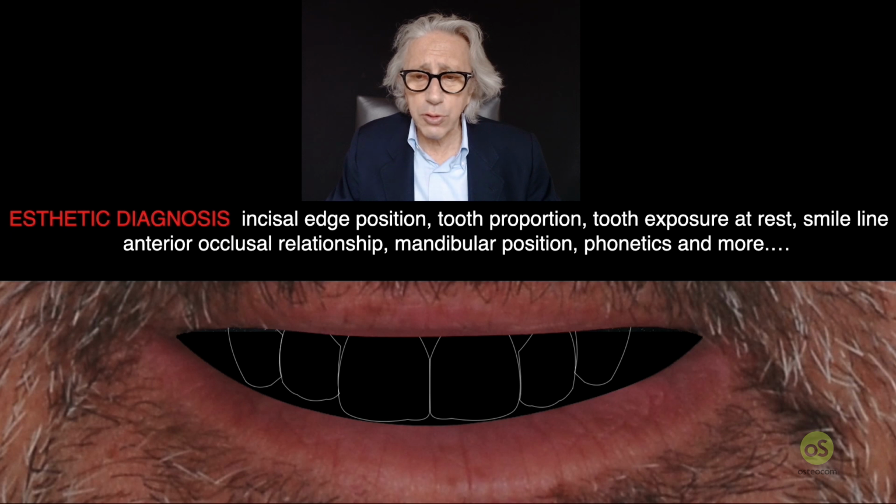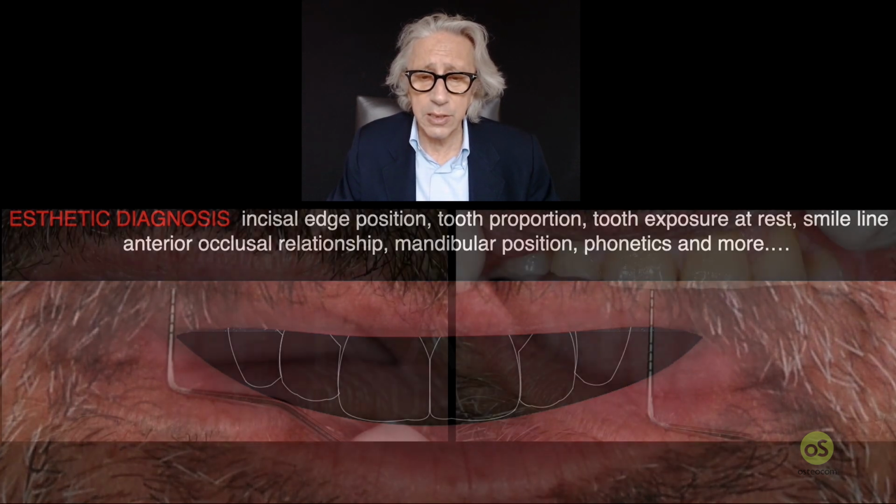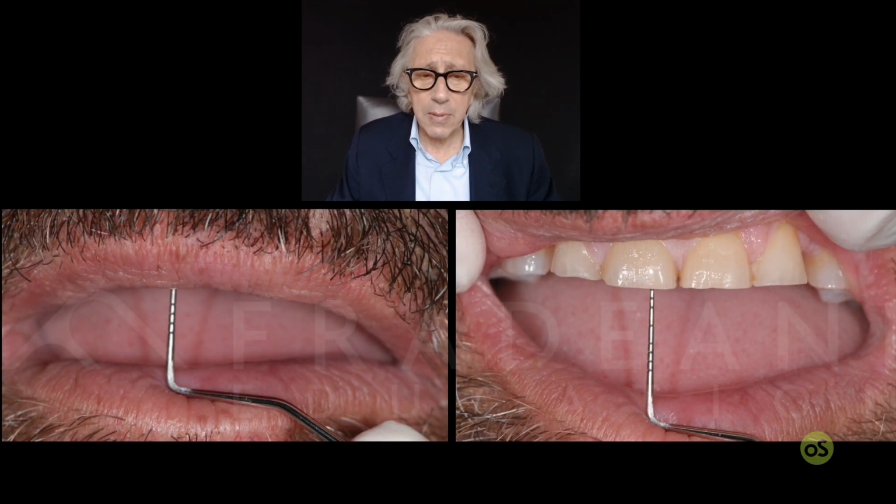Starting from the tooth exposure at rest, the smile line of the patient, the anterior occlusal relationship between upper and lower anteriors, with the overjet overbite ratio, the position of the mandible, whether it is in an acquired position or in CR, and all the phonetic tests. So there are many steps that you should follow in order to catch the real position of the incisal edge.